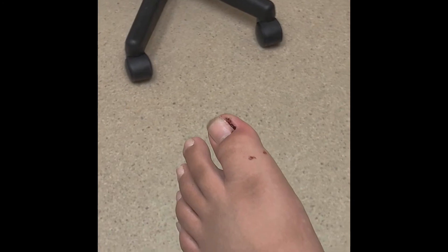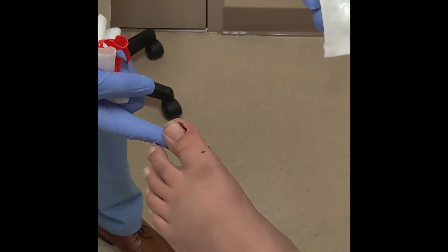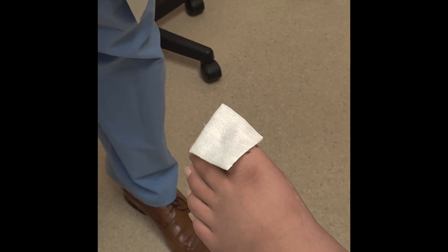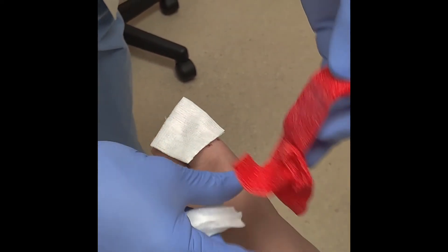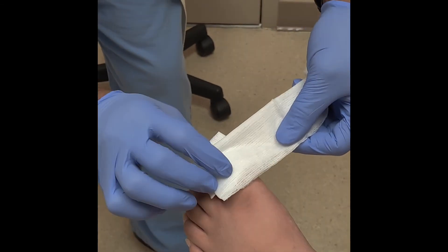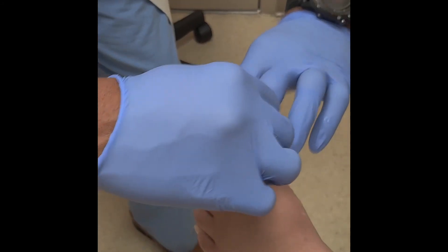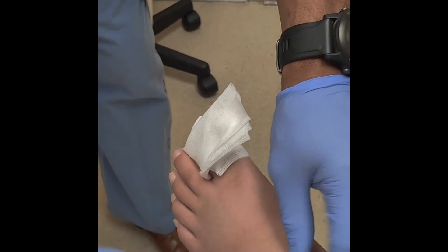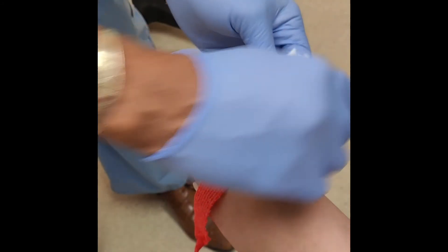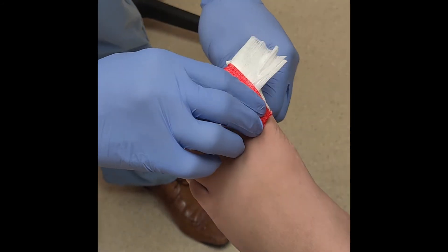And dressings. Voila. So this is Neosporin with some gauze — that goes over there like so. This one I'm going to just drape it here. Some gauze just to wrap around like that. So you want to wash this with soap and water; you don't necessarily have to soak it. Just soap and water is fine. And then this is co-band. You can use a band-aid if you want, but if you're going to use a band-aid, don't put it directly over the wound just because that can macerate it.